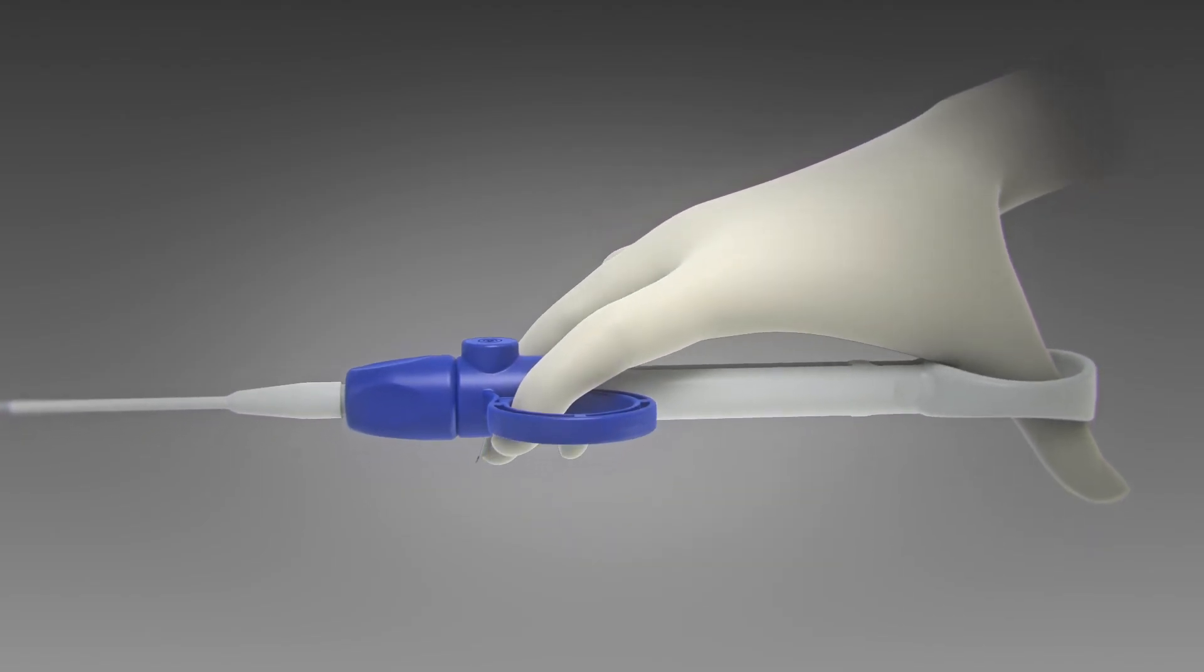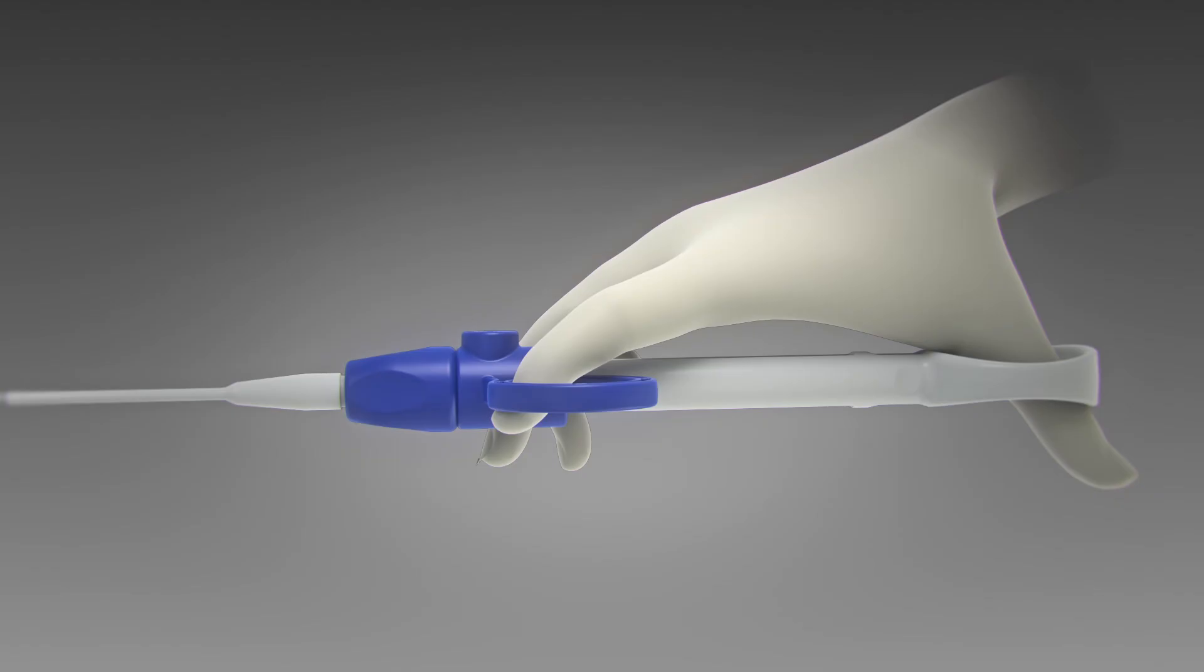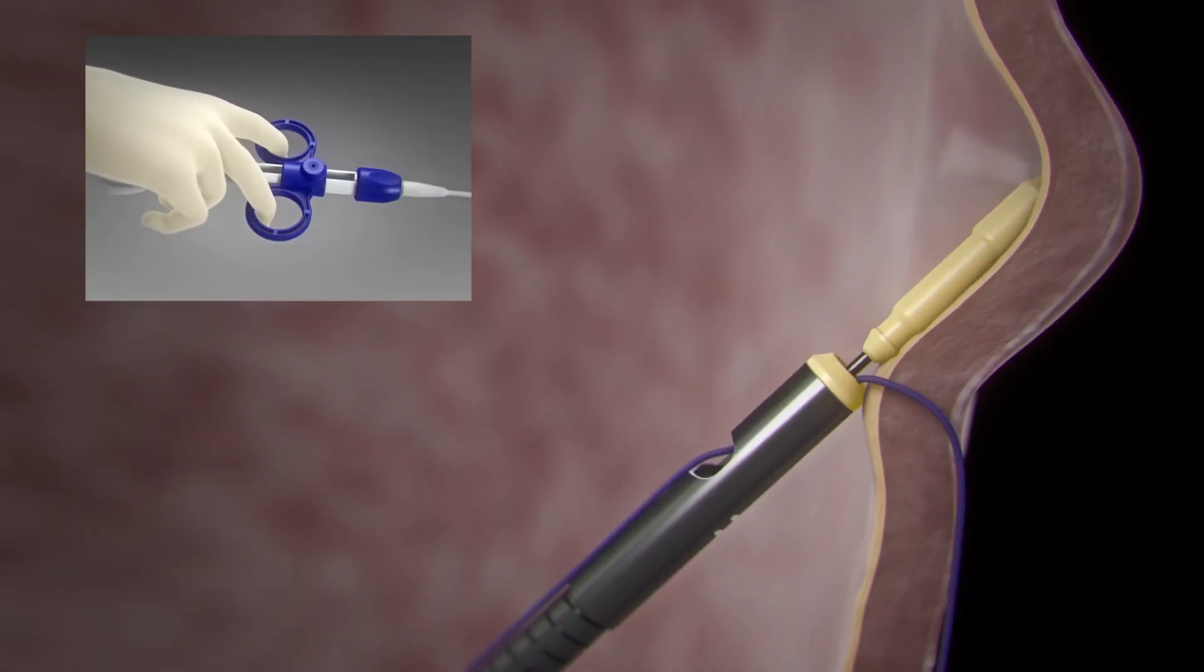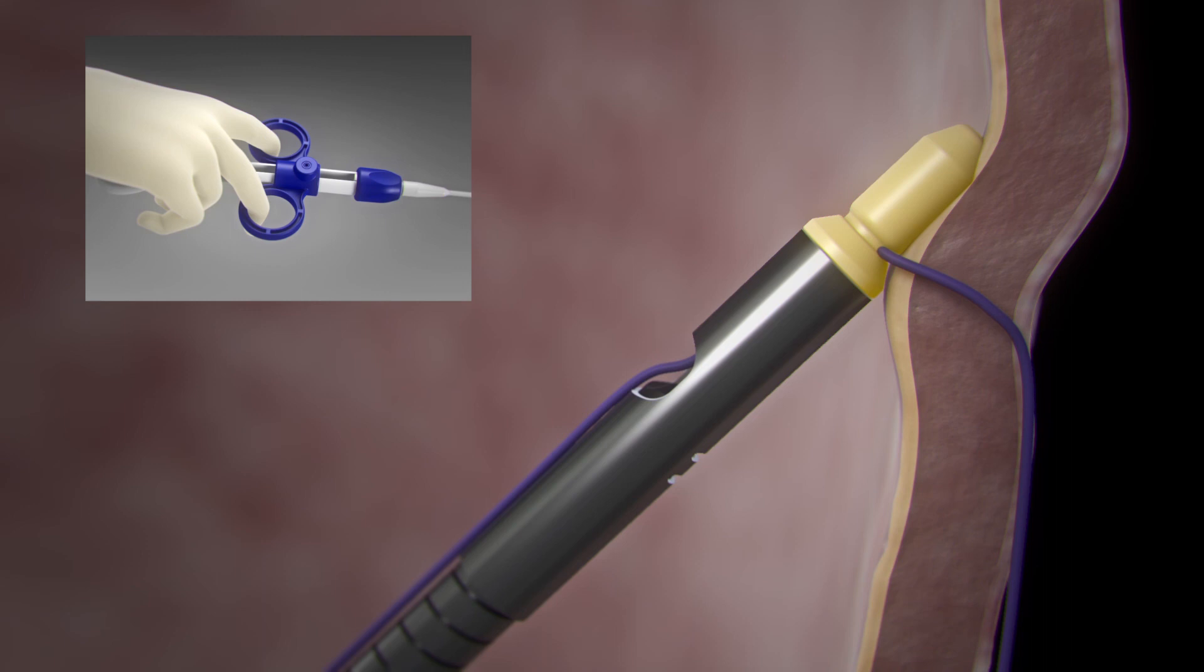Deploying the cinch is completed in three stages. Stage 1: Squeeze the cinch handle with one hand to pull the peak plug into the collar and lock the suture.